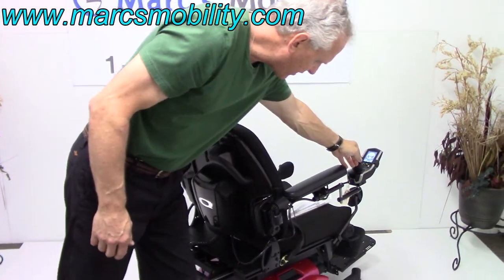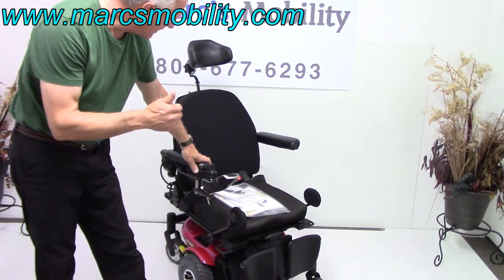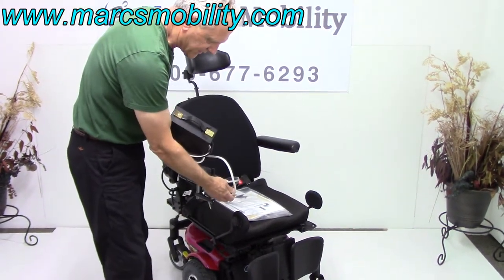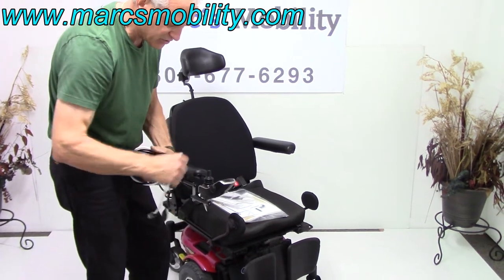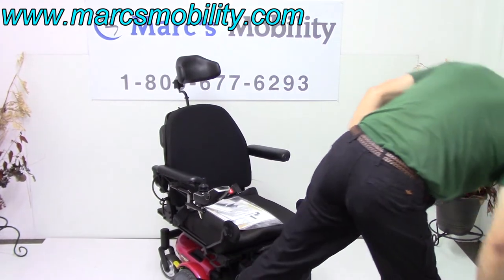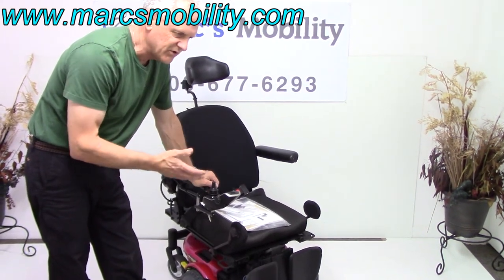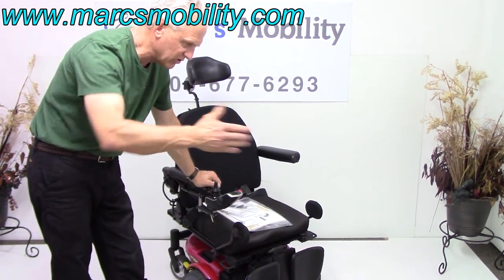This power chair is practically new: electric 10-inch seat lift, electric tilt, electric legs. When you charge this chair, just take your charger, plug it into the bottom of your joystick, and as soon as the lights turn green on your charger, you're fully charged. The charger will know when the batteries are full. This chair will give you anywhere from 10 to 13 miles on a battery charge — a little less if you're using the seat tilt or recline functions.